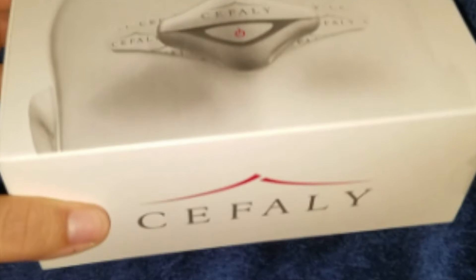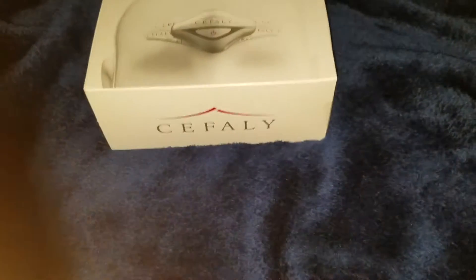It is kind of expensive — it's about $400, not including shipping.